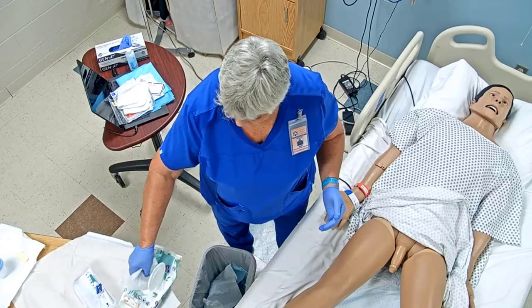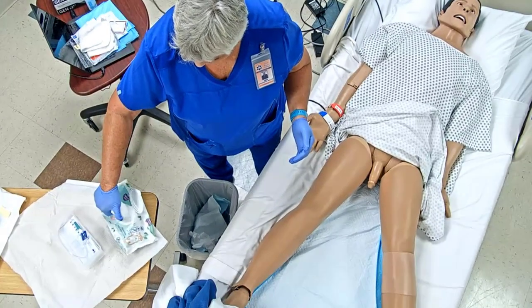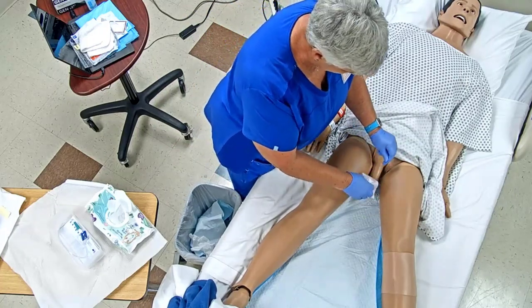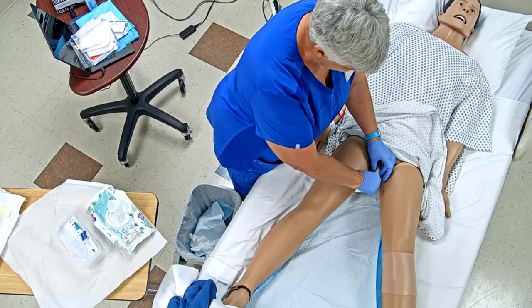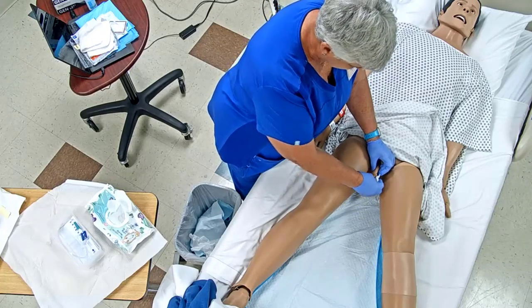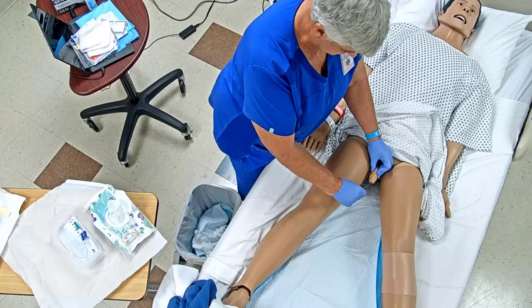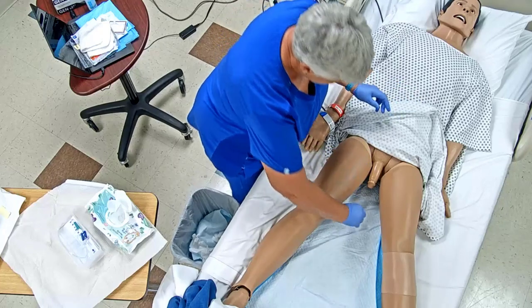Okay, so here you can just state that you did pericare. Okay, so we would do pericare. Now the most important thing, once we've done the pericare on a male, you have to get that foreskin back into its natural position, okay? So we've done our pericare, okay, all four sides. We've got to get that foreskin back into place. Okay, otherwise, and I'll explain that in just a minute. So we've got that in place.